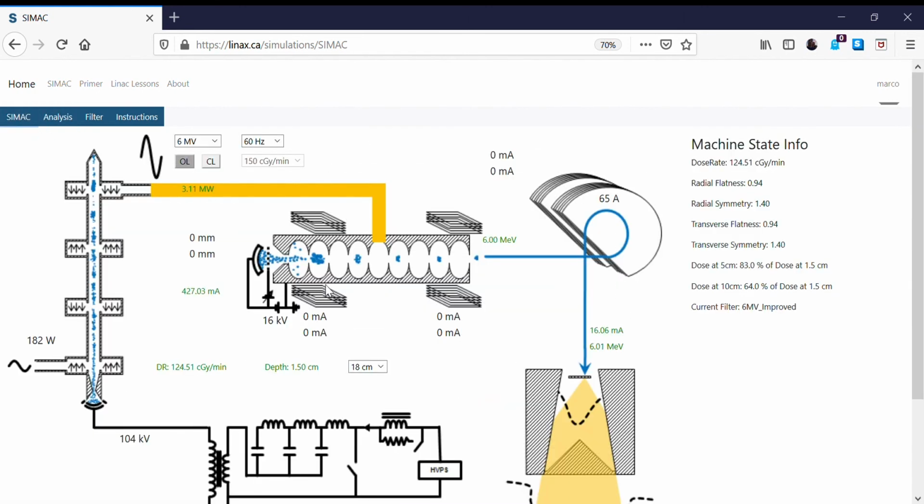So this is the other clinical property that we can explore in SIMAC: the property of symmetry. We saw in previous videos that the beam energy can affect the beam flatness, and we can change the beam energy in a number of ways, and we can also adjust the flattening filter. But we can also have symmetry errors as a result of gun problems. Gun problems happen mainly as guns age, and the electron emissivity from the gun surface can change due to the aging of the gun, and that can lead to the gun not being perfectly symmetric. And then, as we see in this example here, that leads to an asymmetric beam.